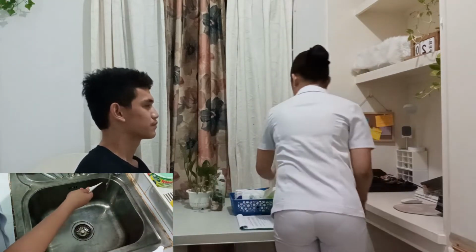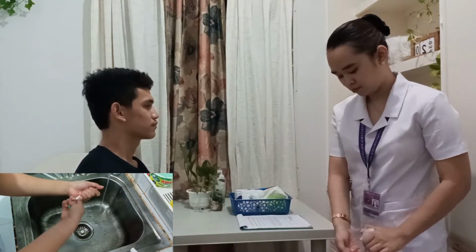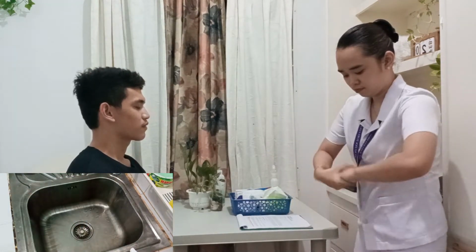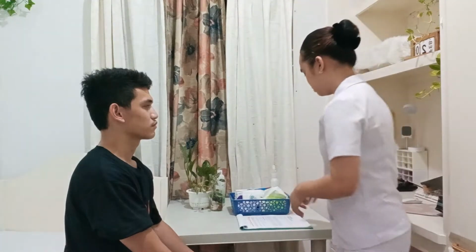Now I will remove my gloves and perform hand hygiene to prevent the spread of microorganisms, and also I will wash the thermometer for further disinfection. Now that I'm done disinfecting, I will now document the temperature of my patient to his TPR sheet.